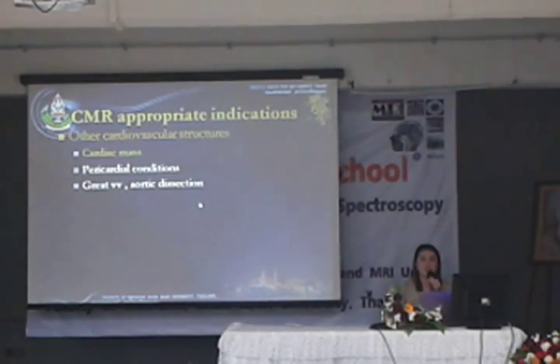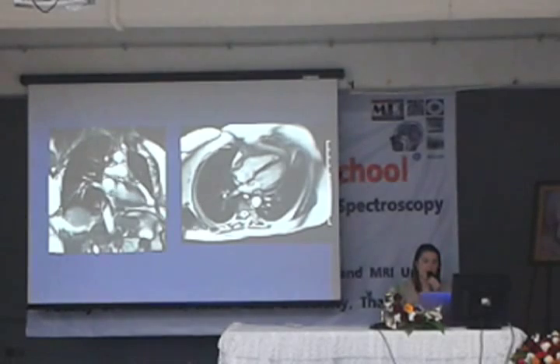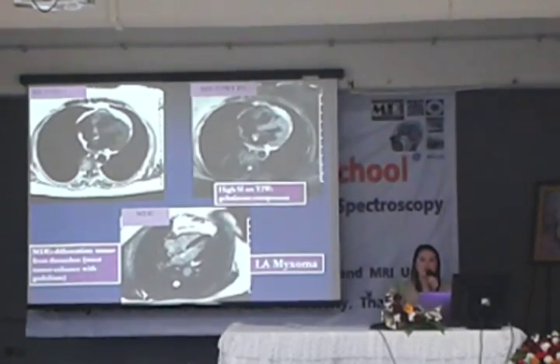The next indication is for evaluation of cardiac mass. This patient shows an abnormal mass within the left atrium that is highly mobile. And we use black blood images for further tissue characterization. The black blood T2 weighted image of this patient shows high signal intensity of this mass because this tumor has a gelatinous component, and the myocardial delayed enhancement shows enhancement of this mass.